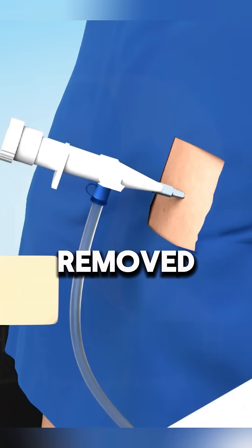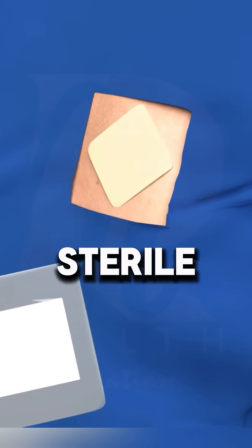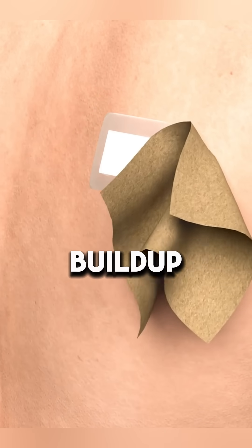Once the fluid is removed, the cannula is taken out, the area is cleaned, and a sterile bandage is applied to prevent infection. This minimally invasive procedure helps diagnose and treat lung fluid buildup.